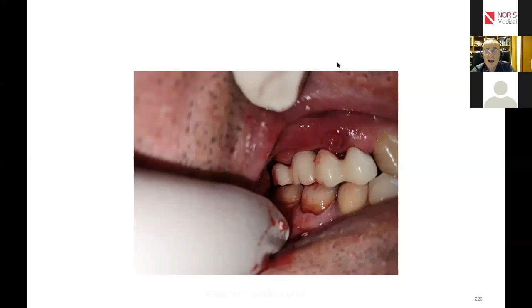Another question that I'm asked, when not extracting teeth, do you use a surgical guide stent with the mono implants? I think that the mono implants are, as far as I know, used freehand. I think that this is their ideal use. I don't use surgical stents, but maybe this is because I have fewer patients than others.